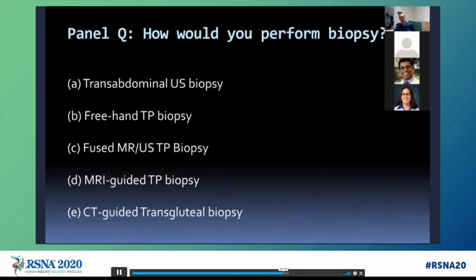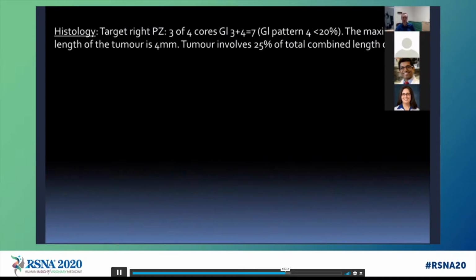So I would join a urology colleague in theatre. I'd be scanning with an abdominal probe in the sagittal plane across the symphysis pubis, and roughly guiding the needle essentially to quadrants, near field quadrant or far field quadrant. It's not a particularly precise guidance that you can provide, because as you're scanning, the needle is coming across your ultrasound probe, so it's very difficult to see the tip of the needle. But we did get tissue in this case, and as you sort of implied, Arvind, it tends to be a sort of saturation biopsy approach to the area of concern.